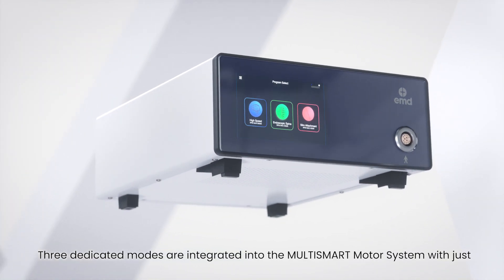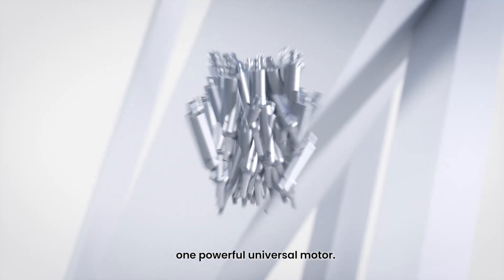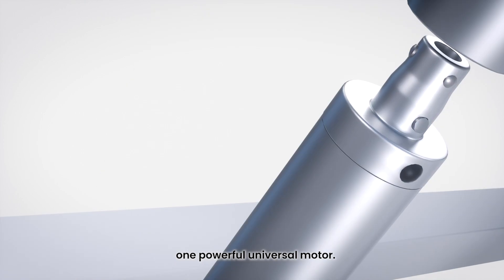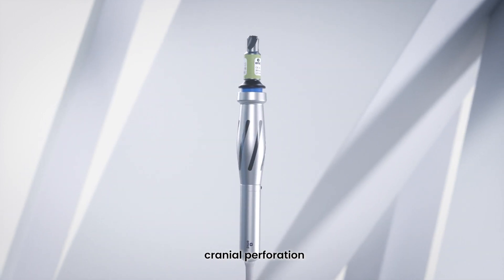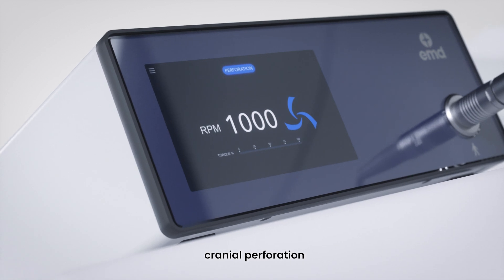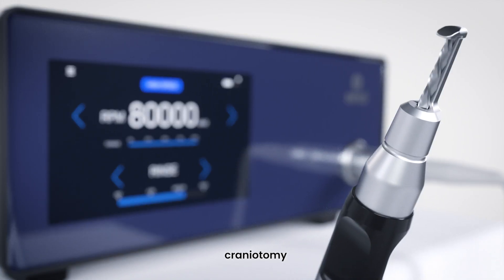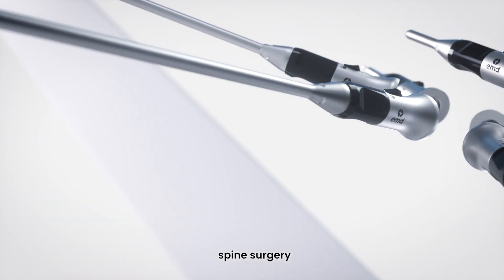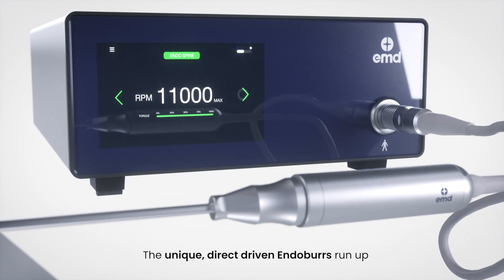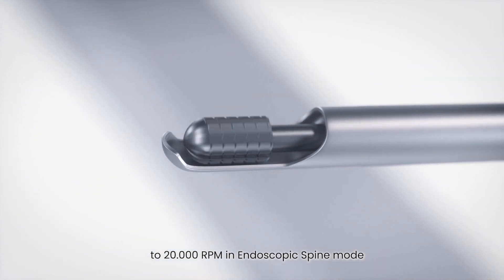Three dedicated modes are integrated into the Multismart motor system with just one powerful universal motor. The three main functions of this device: high speed mode is dedicated for cranial perforation, craniotomy, and spine surgery. The unique direct-driven endo-burrs run up to 20,000 RPM in endoscopic spine mode.